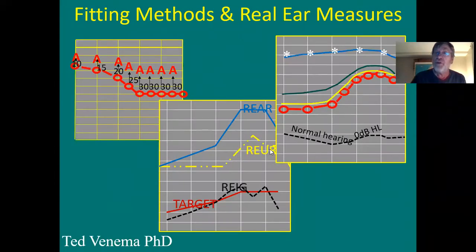Let me see. Here you go. Look at the picture here. The yellow. They put a tube in the guy's ear canal and with 50 dB sound measured his ear canal resonance. Oh, there's his peak at 2700 hertz. Look at his outer ear canal resonance.